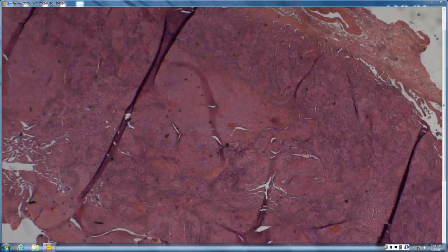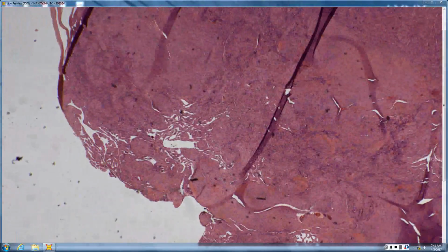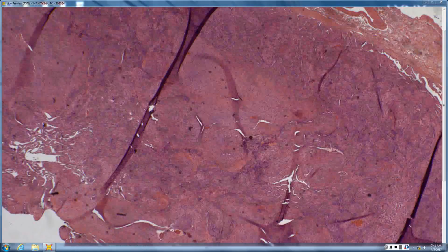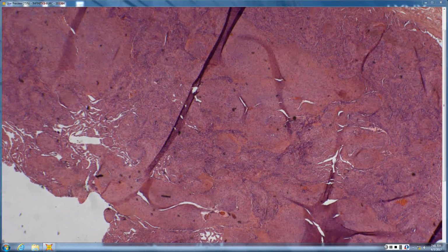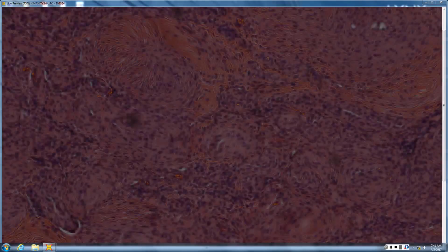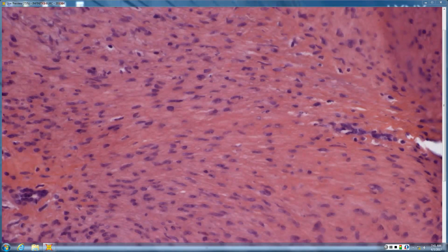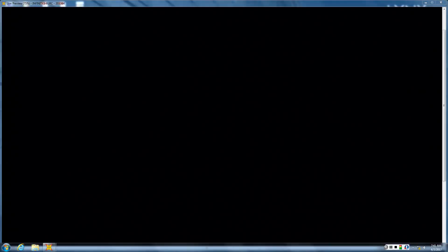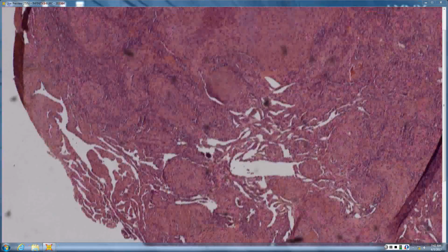So we're in the deep soft tissue. It's a big chunk with some small vessels, slits inside of it. And if you look here, how would you characterize the cell type? Yes, they look pretty spindly. Okay, so there are wide areas that are just spindle cells. Do you know any kind of spindle cell hemangioma? Well, there is that, right?